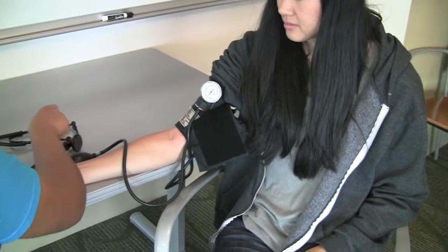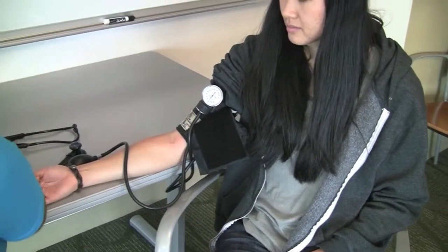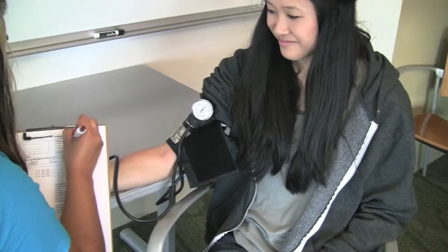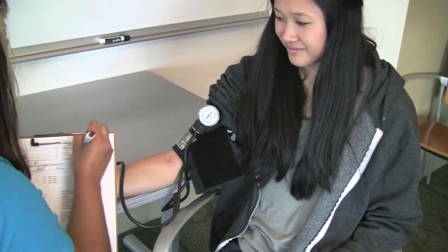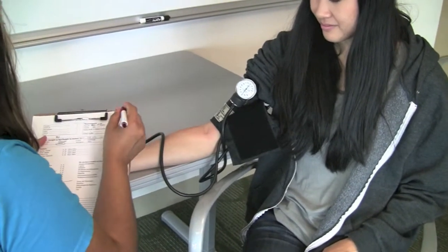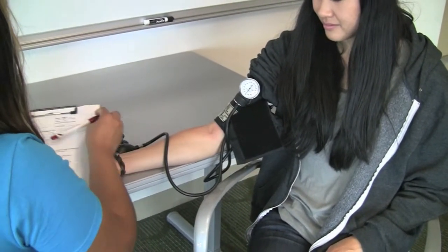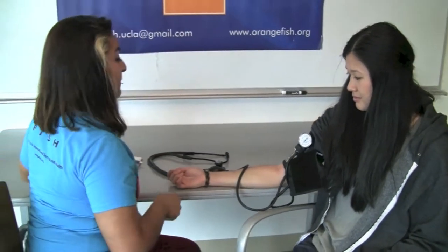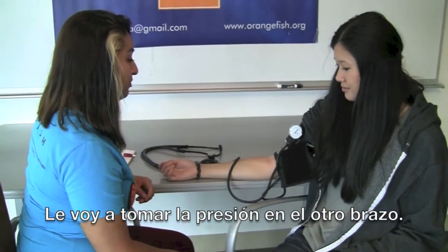Report the two numbers on the patient's clinic sheet. If unable to obtain an accurate reading, repeat the procedure on the opposite arm. If this occurs, tell the patient that you will need to take their blood pressure on the opposite arm. In Spanish, say: "Le voy a tomar la presión en otro brazo."